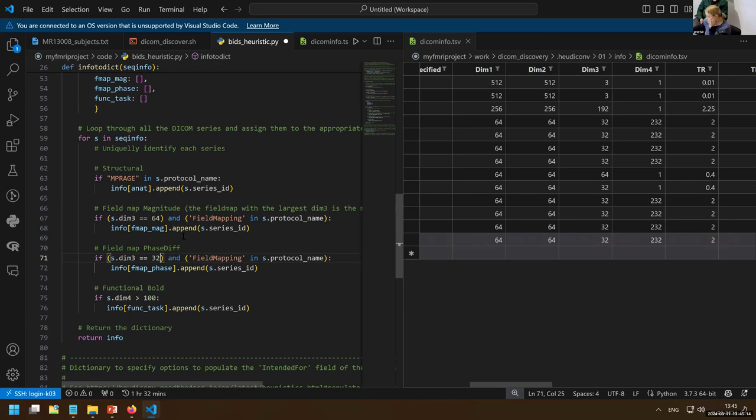Yeah, so what you can do, Rick, to answer your question about how you avoid mixing up scans that have been aborted: we always set dimension 4 to be the total length of the completed run. That would work as a sequence of random completion, but maybe you find at the end that the subject has not done the task, or the button presses weren't recorded and you run something again. There are always situations where it's hard to filter just on the dimension.